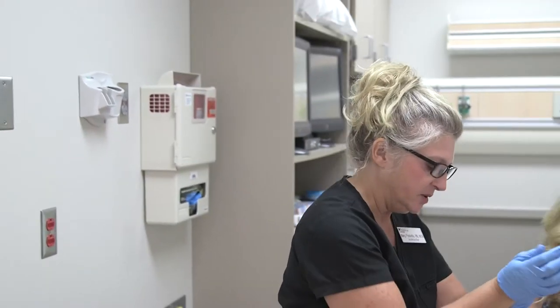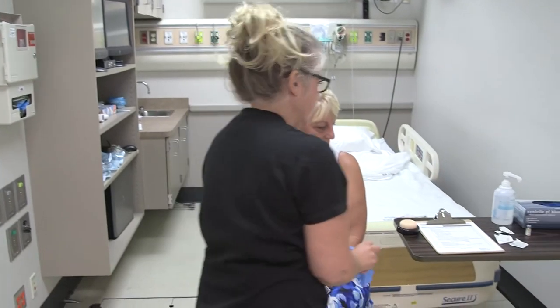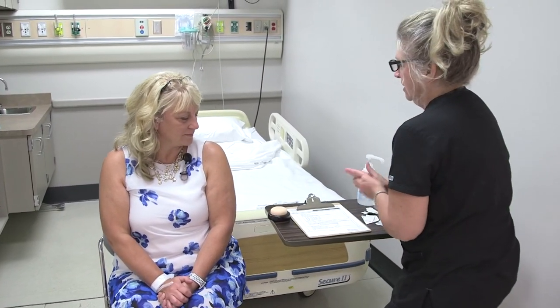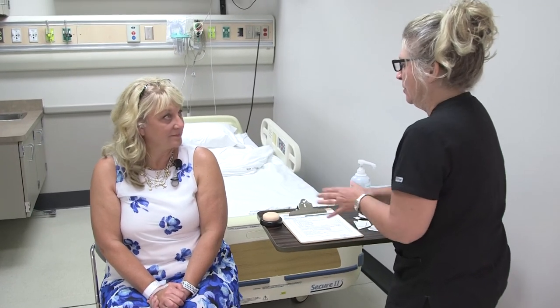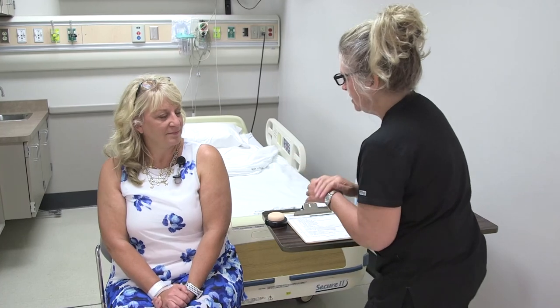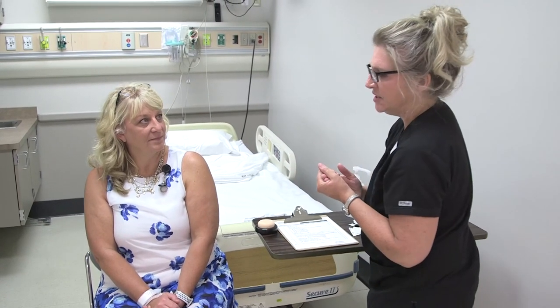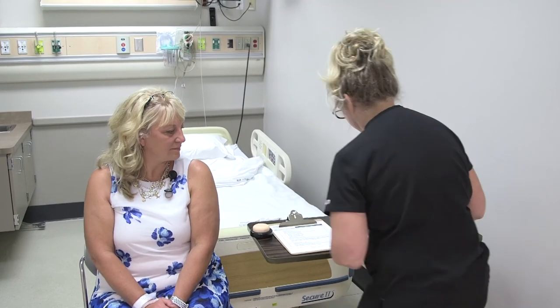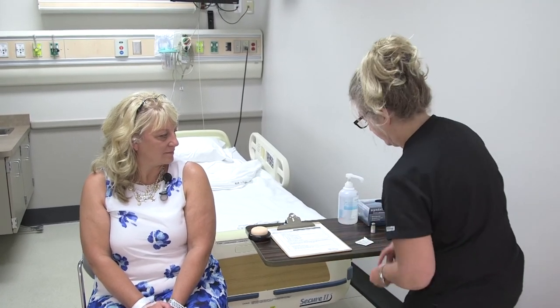Okay, now I'm going to go ahead and remove my gloves, wash my hands, and I'm going to go ahead and check the injection site. It looks good. I don't see any swelling or bruising. We would have also assessed the injection site prior to giving the medication as well to make sure that it's an appropriate place to give it.